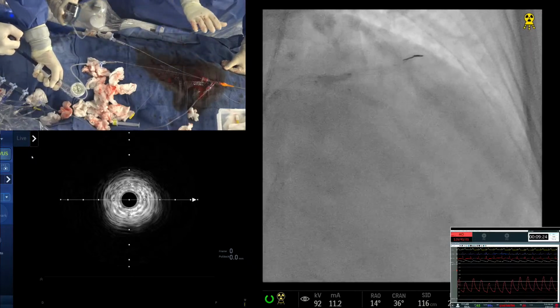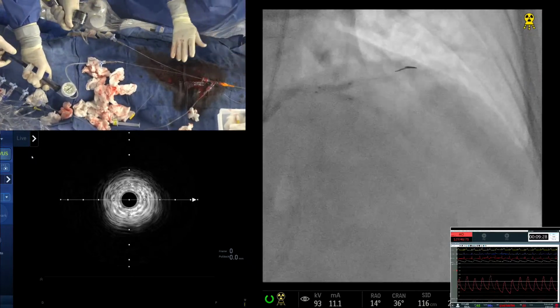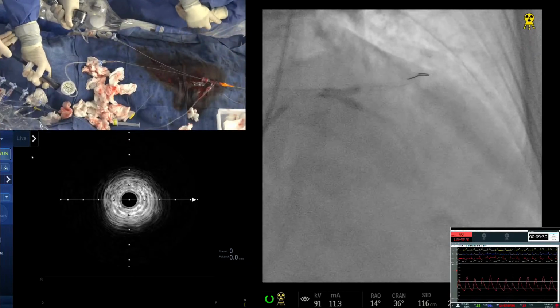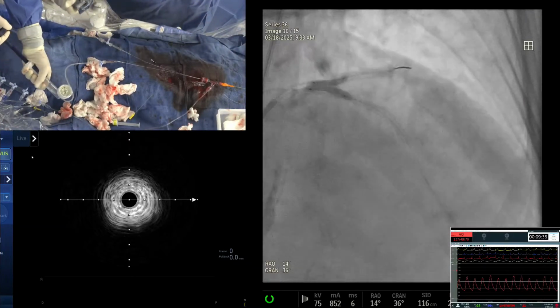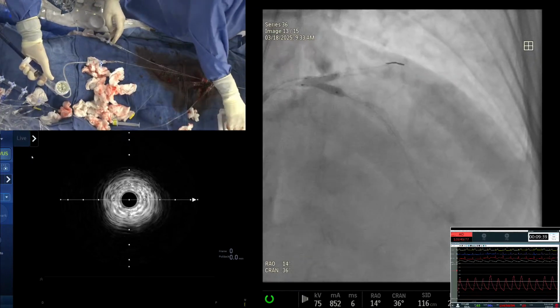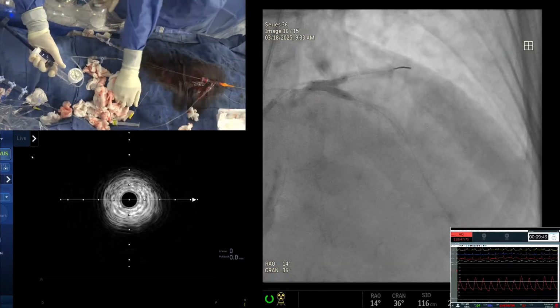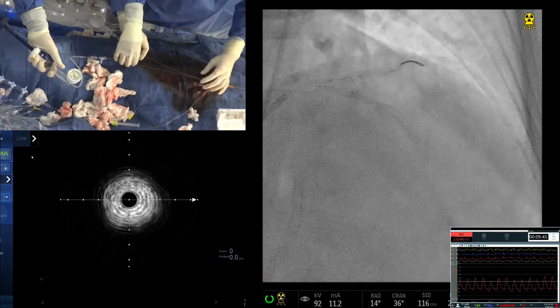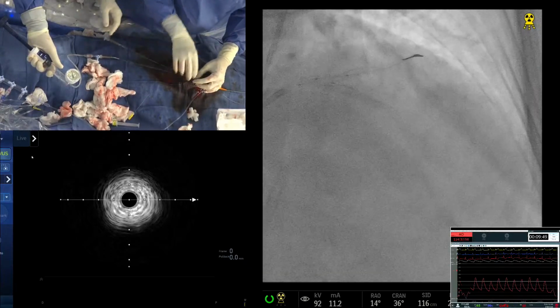No, but the exercise we did is what we teach even in the app. That is, if you recross a few times, go to a different cell. Then you go with the smallest balloon. When you're recrossing, that itself is going to give you an idea. If you recross very well the first time, and this usually we see in calcific lesions, when there's calcium in the main vessel and calcium in the side branch, then recrossing.